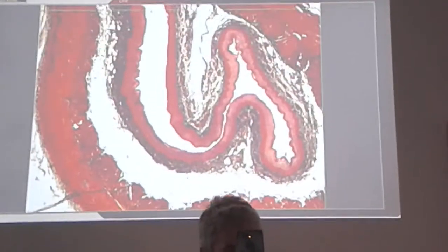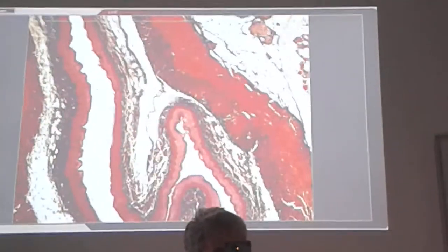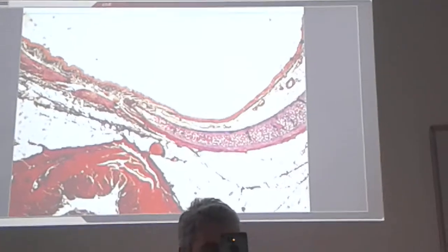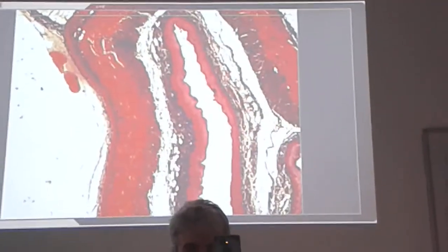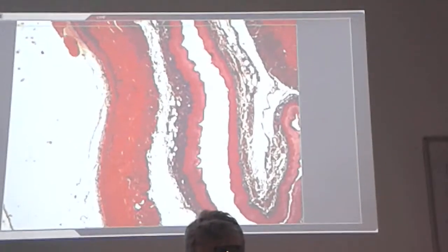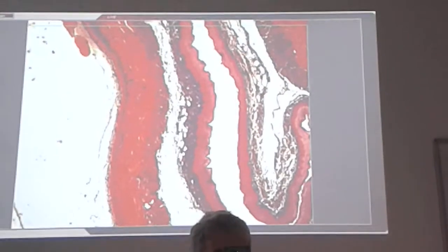When we investigate the esophagus, you can always have a compound structure or compound section, both going through the trachea anteriorly and the esophagus posteriorly. So if you have your section and put it under the microscope, please first of all try to recognize the structures at the lowest magnification.